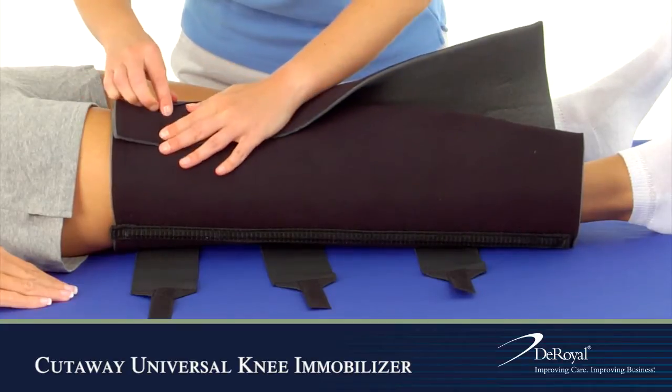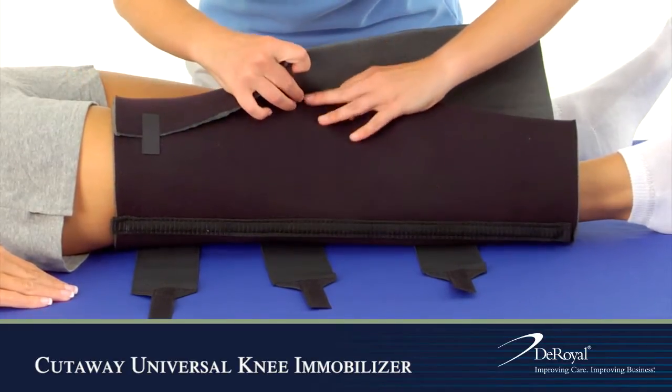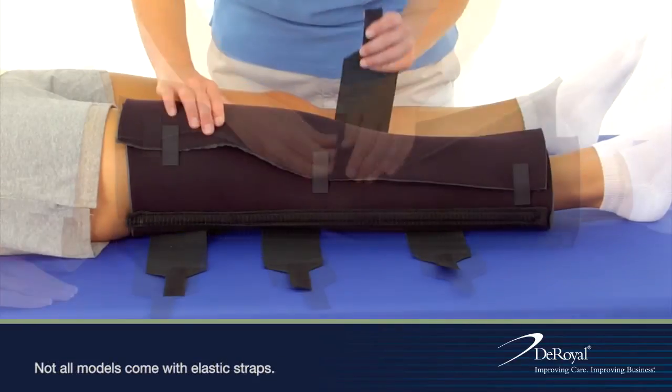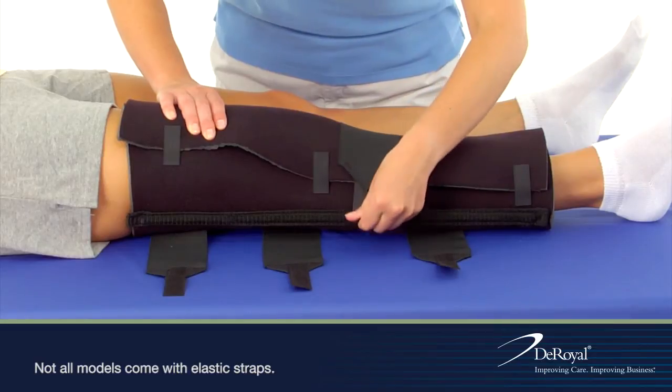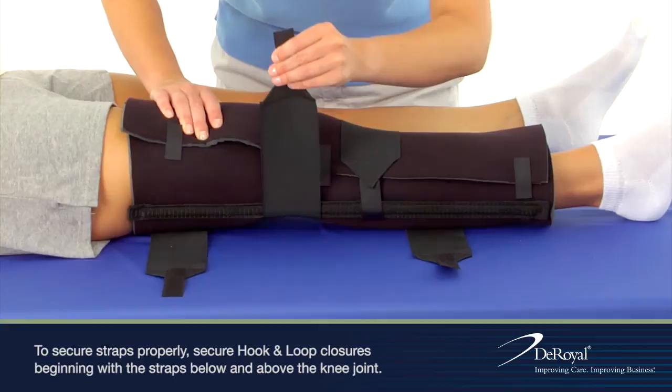Using the small hook and loop tabs to assist you, secure each of the elastic bands with the attached hook and loop. Secure straps properly, beginning with the straps below and above the knee joint.